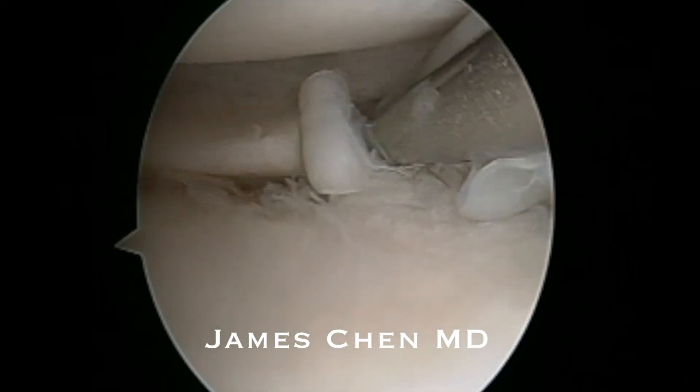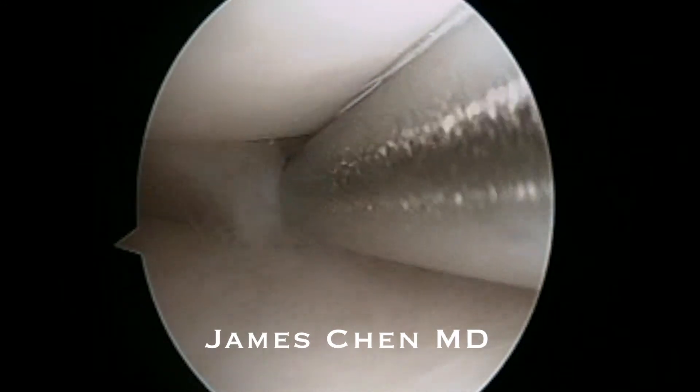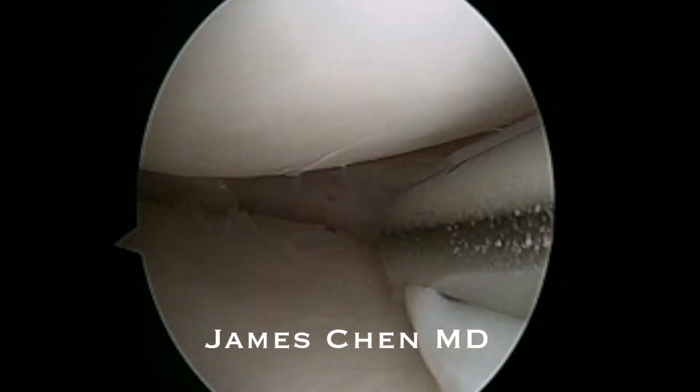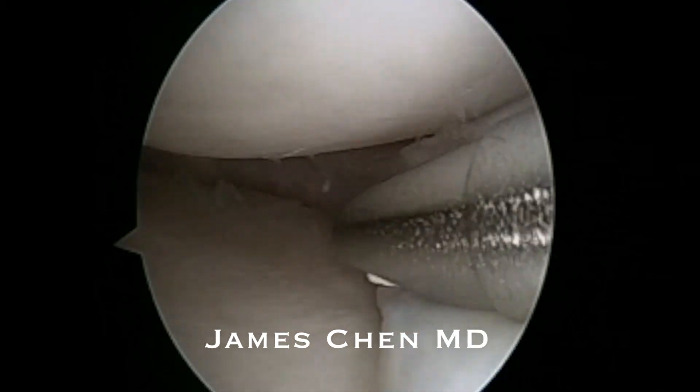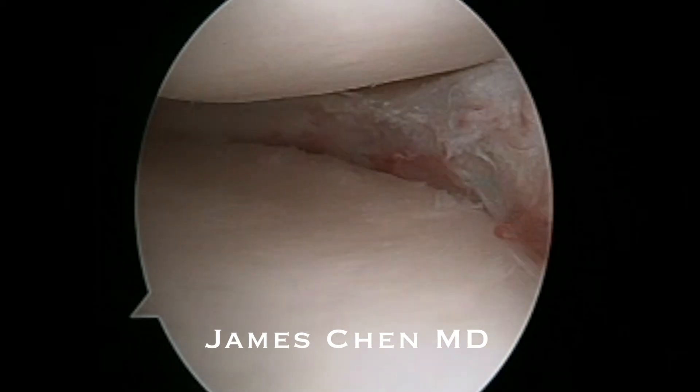This is why vertical tunnel placement is not ideal. Here I am removing the meniscus with a shaver, and you can see the residual meniscus left.